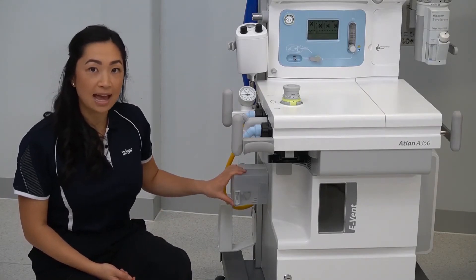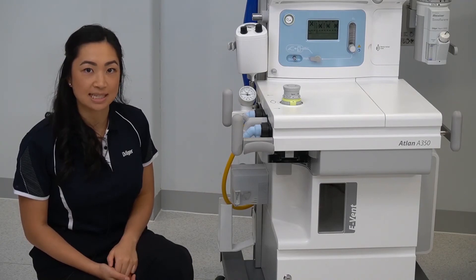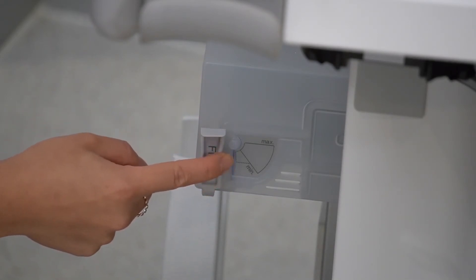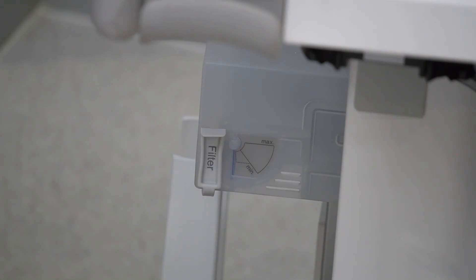Located to the side of the ATLAN, under the manual pressure gauge, is an anaesthetic gas scavenging system. When appropriately connected, the blue flap resting against this back wall will be floating between the min and the max lines. This will indicate adequate scavenging levels.